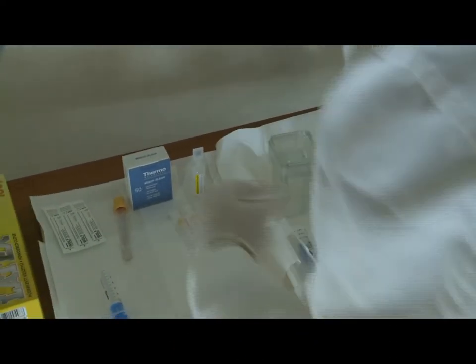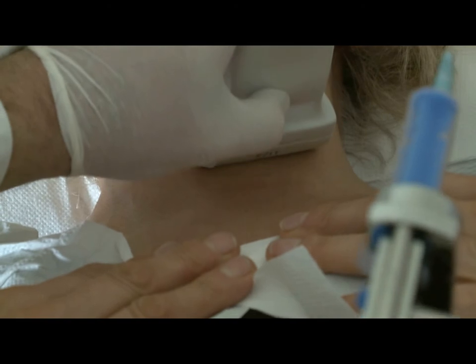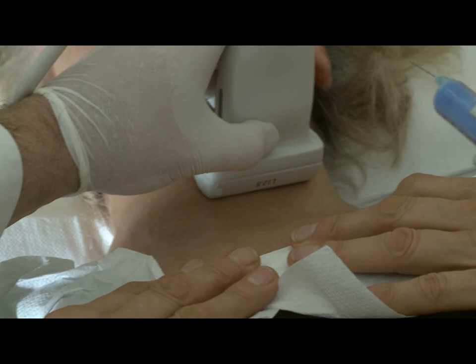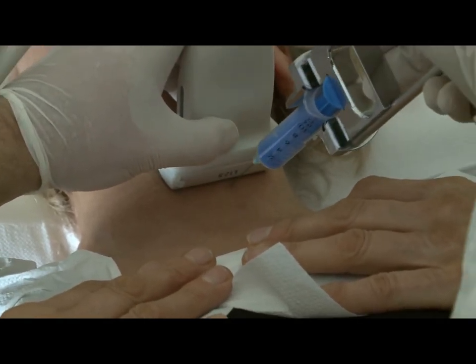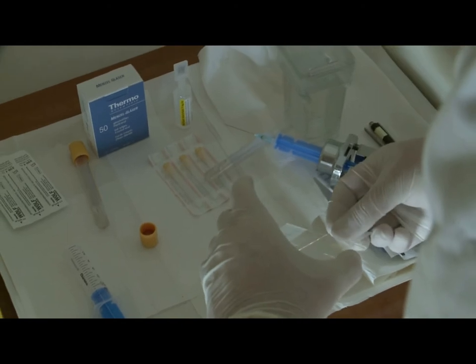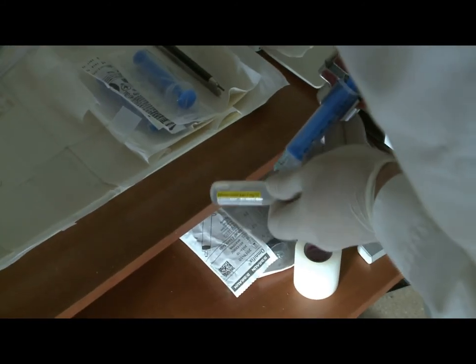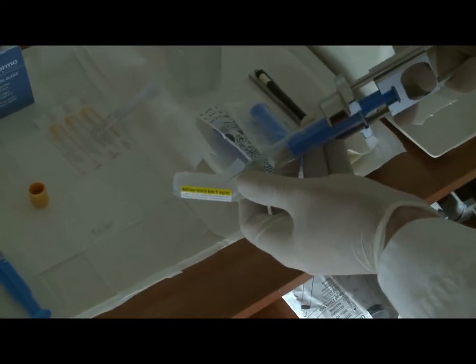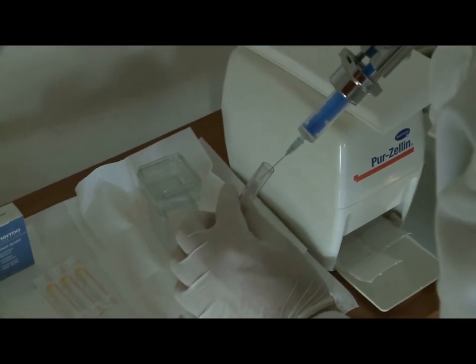So let's see how to perform it. To spare time, we remove the cap from the tube. Then we perform a usual sampling — in this patient, aspirational cytology. We prepare now the smear. Thereafter, we draw one milliliter of saline through the needle into the syringe. Then this one milliliter of fluid is injected through the needle into the tube.